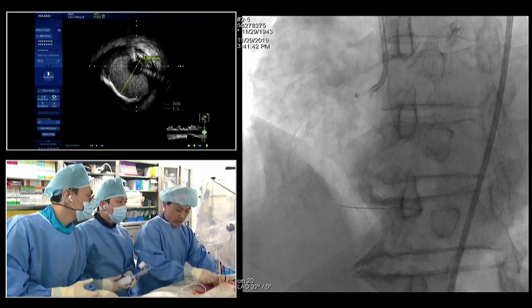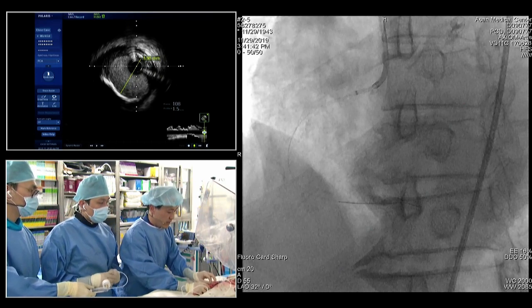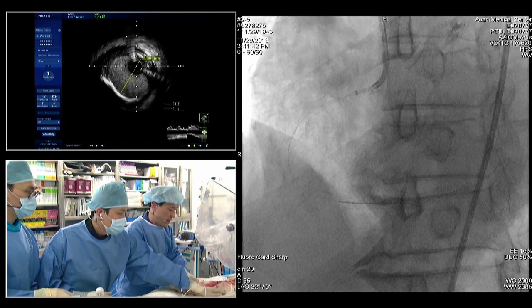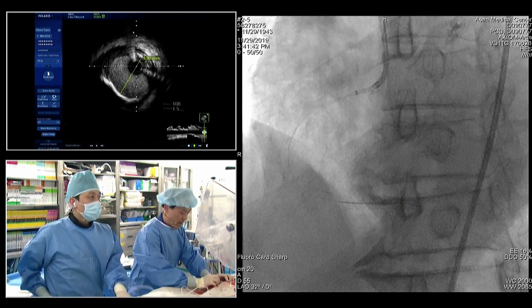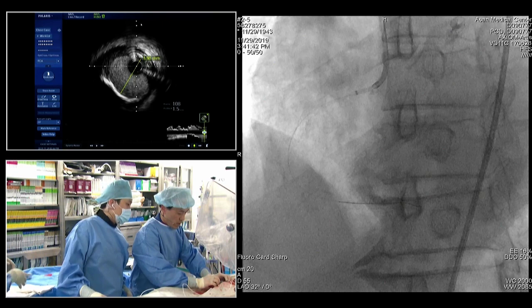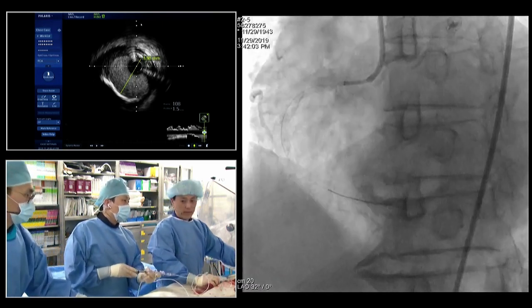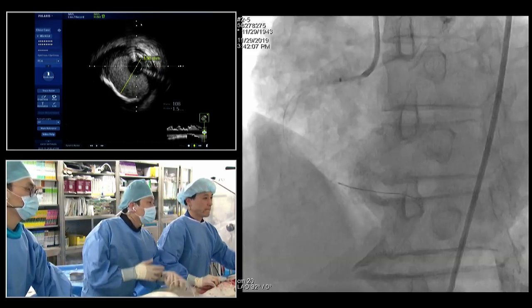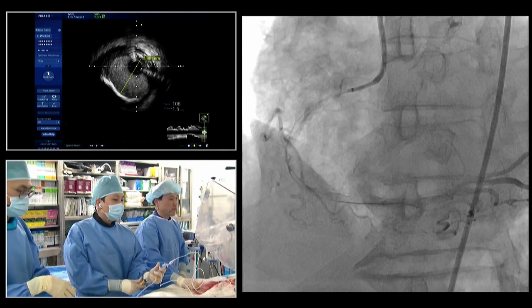Okay, I'm not going to even try to inject because a big balloon guide liner is not going to be great, so give me 5 seconds, we'll take this out and take a picture here. Okay, I'm just going to back bleed because I don't want any big bubbles to occur. Okay, let's spike the catheter, please. Give me a little puff. Okay, ready? Great. Inject. Good. Perfect results, right?